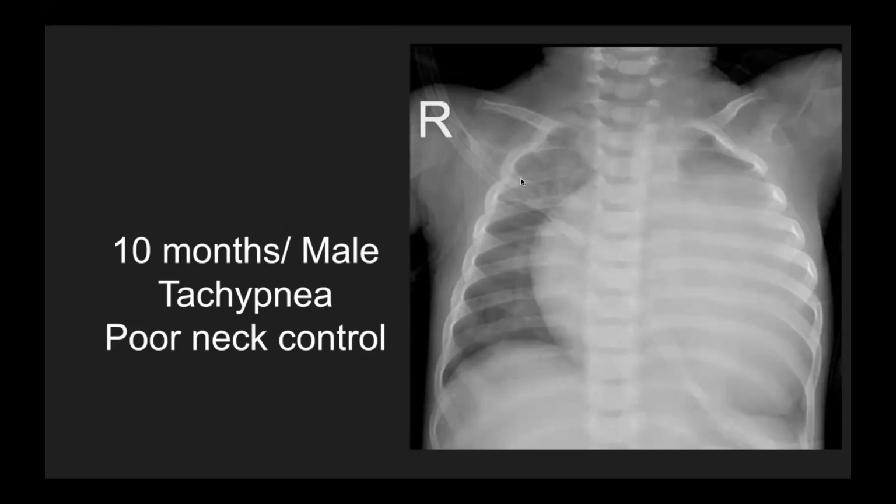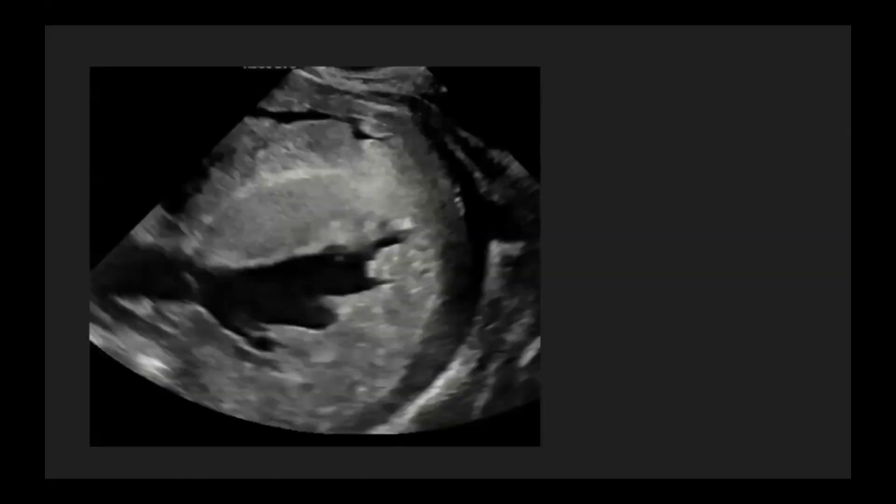So doing a bedside echo is not that difficult, because if it is a cardiac cause, then almost the entire left hemithorax is filled with the heart only. So wherever you put the probe, you would get to see what it is. And what it is, is a big, huge, thick heart. So this is the interventricular septum. We can see this interventricular septum is this big. Not only big, the echogenicity is also abnormal.